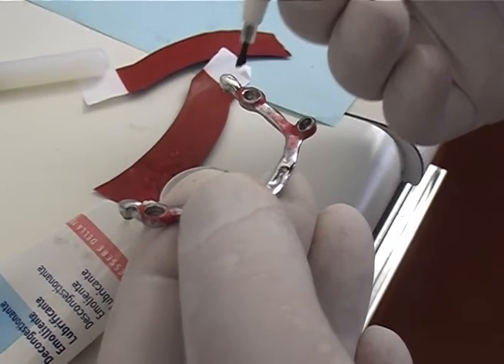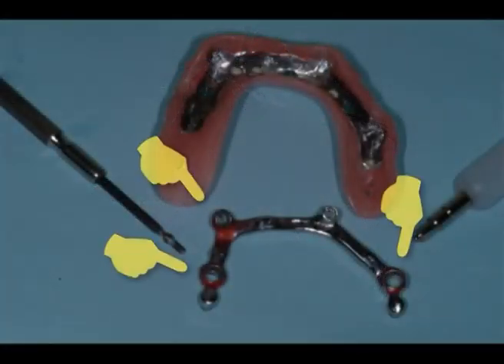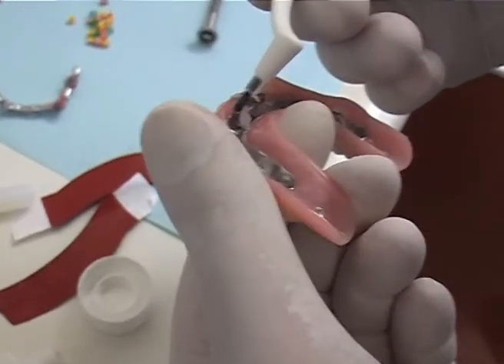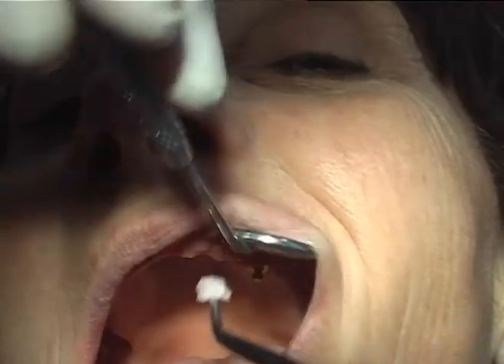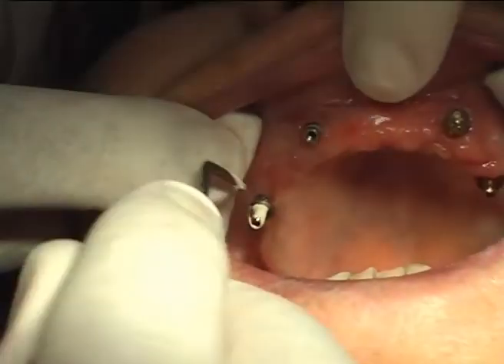After these trials, unscrew and remove the bar. In addition to the soft wax layer, also insulate the bar sections connecting to the tissues, but do not insulate the internal area of the annular blocks. The removable structure needs to be insulated too. Remove any remaining grease that might be present from every part that is to be cemented.